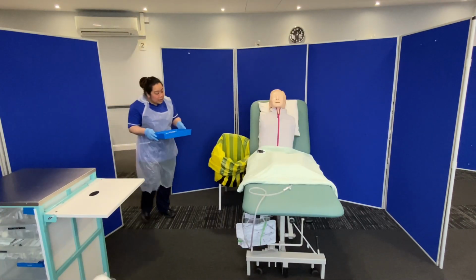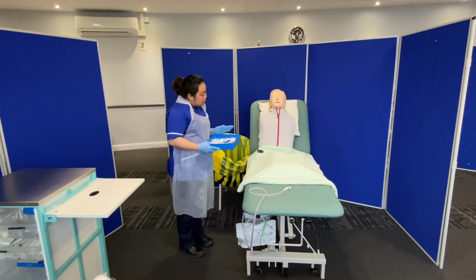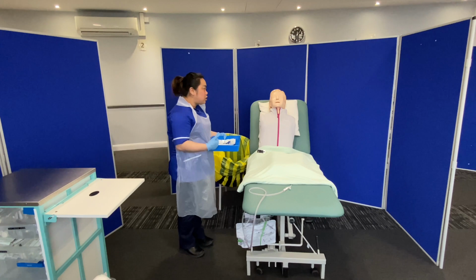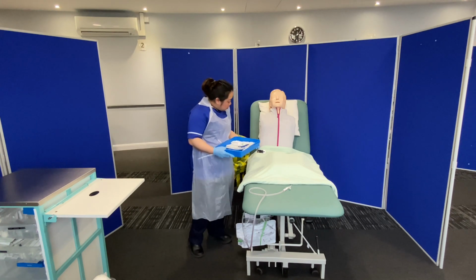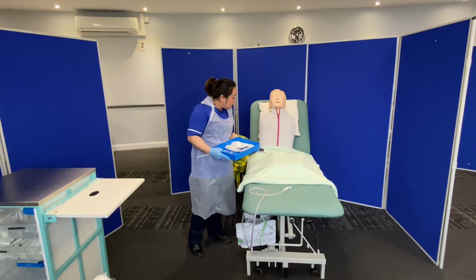Hello, good morning, Lindsay. I'm back. Good morning. I've got my equipment with me. First, I need to do a couple of things. One is I'm gonna ask permission if I can move things around in your room so that everything will be accessible. And two, I'd like to check your identity again against your wristband, if that's okay. That's okay. Right? Can you tell me your name and date of birth? Lindsay Lujan, 1/1/88. Right? MRN number is 1234567X.